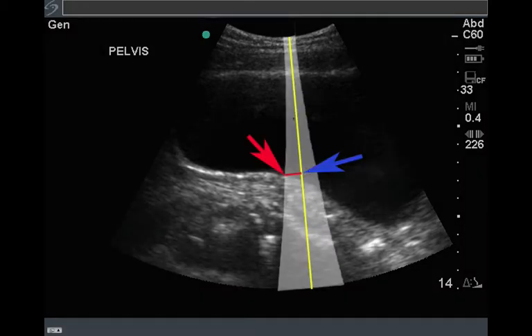To complicate things further, as well as this torch-like beam, the ultrasound machine also sends down side lobes, which again cause artifacts, which are actually lobes that come off like this, that can also hit and reflect echoes, and the ultrasound machine thinks of them being a single central line. So you can get artifacts cast by side lobes, which are sort of like increased beam width.